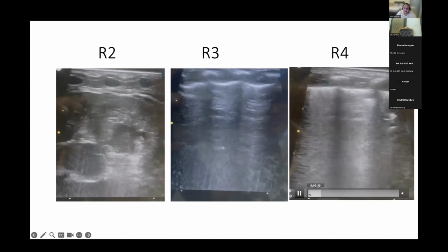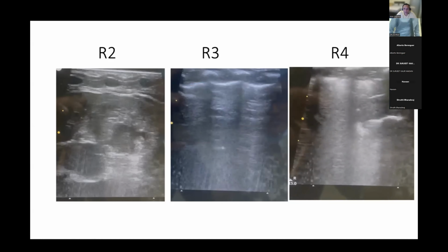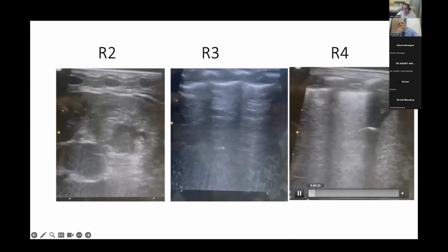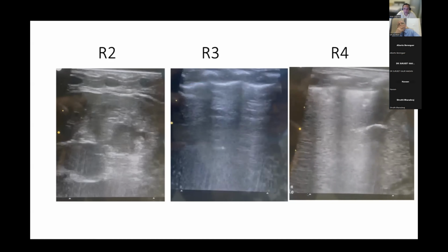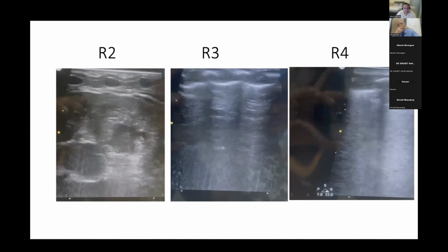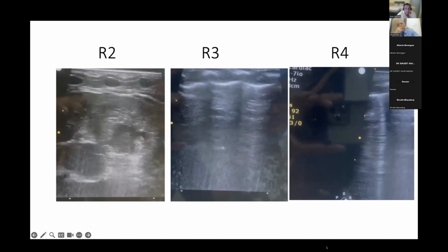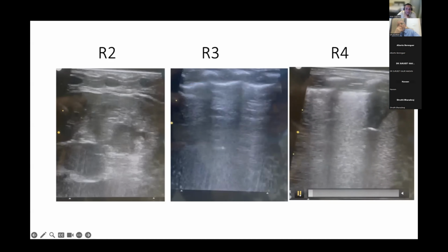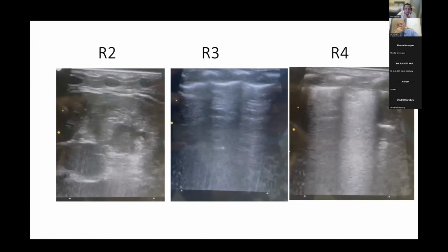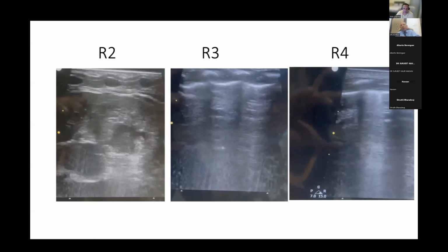But this area here is also a common area where you find what is called occult atelectasis. Often babies are completely asymptomatic when they're born, and don't have the lung bases recruited. And you get this area where, if you remember Douglas Blank's article, you don't have aeration of the lower parts of the lung when the baby's born. And classically, what you find is they're asymptomatic, but because of a lack of aeration, you get this, I would say, triangular appearance. But in this case, this baby is clearly very symptomatic.